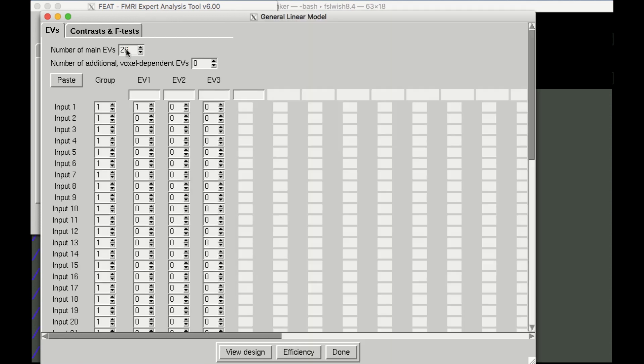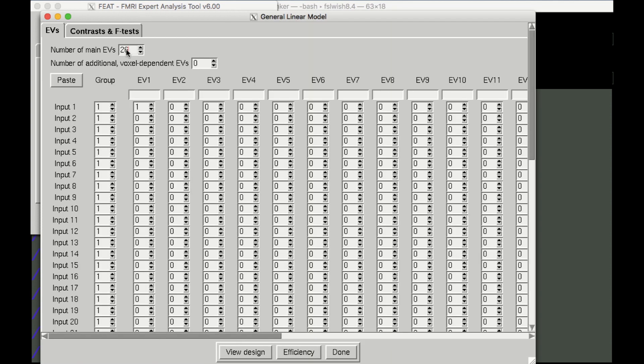Then, either using the keyboard or the arrows next to each field, change the numbers in each column to 1, where you want to take the average for the contrast estimates for that subject.